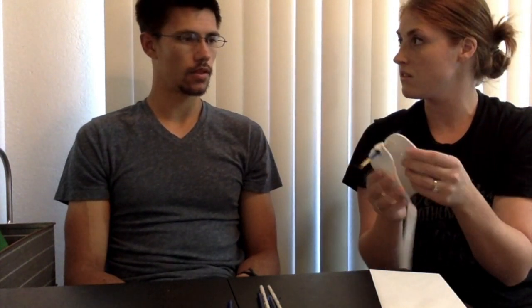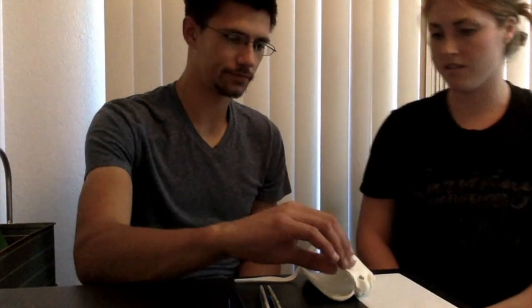How does that sound? Sounds pretty good. Do you have any questions? No. Alright, Steven, so I'm going to take this apart so that it can be set up just as it would at your house or wherever you're painting. And then I'm going to have you set it up so that you can paint yourself, okay? Okay. So I'm going to set it right here — go ahead and get started.